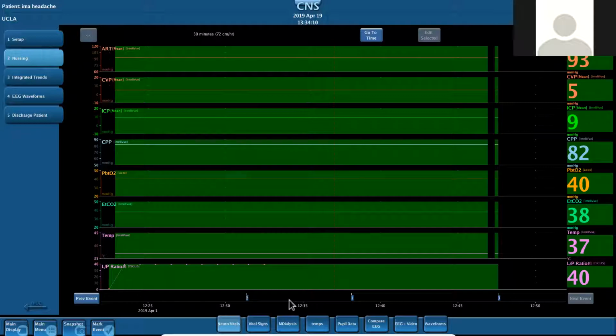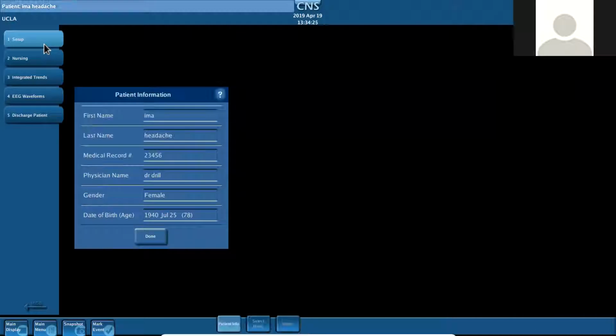So have you had to do that much, Kathy, with your babies? Go back and alter the record like that? I think probably just similar to what you've mentioned about more about the naming. We maybe forgot to complete the birthday or those fields, but I won't say that we've gone back and annotated it. I won't say that maybe some of our physician colleagues maybe have, but to add extra events or other things. But us as nurses, I think mostly we just do the patient info.